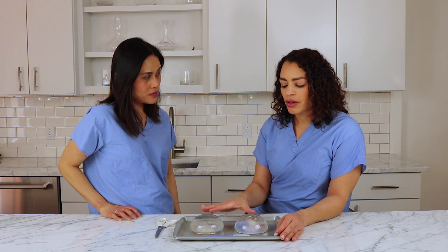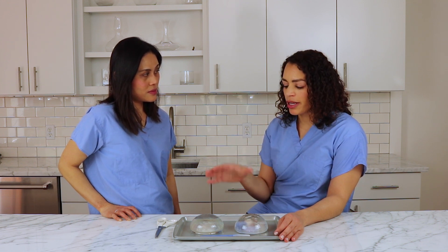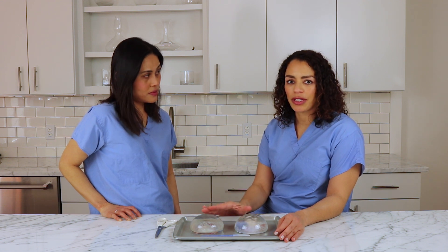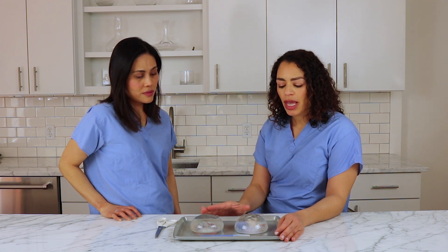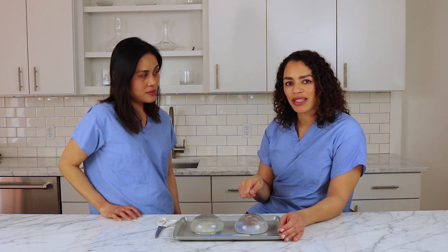These two silicone breast implants are made of what we call cohesive gel, which is the firmest type of silicone out there on the market. This is the latest generation of breast implants available. We're going to essentially use a scalpel to cut the breast implant so that you can see what's on the inside.